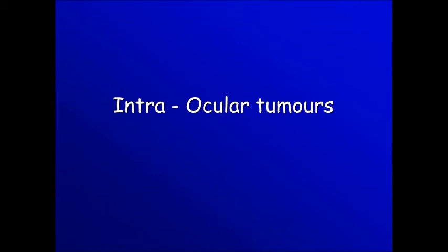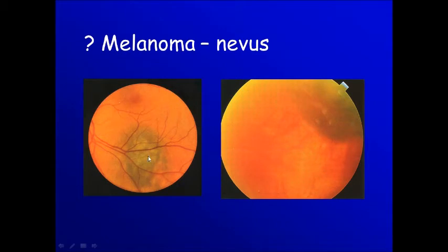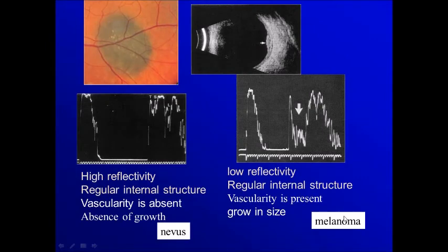Now I want to go to the different intraocular tumors. Here we have a pigmented lesion and we are not sure whether it is a nevus or a melanoma. If it's a nevus, then it's just pigmented cells in a normal choroid, so the reflectivity is high with a regular internal structure. But if it's a mass of cells with no septa in between, then the reflectivity will be low — this is the case of melanoma.